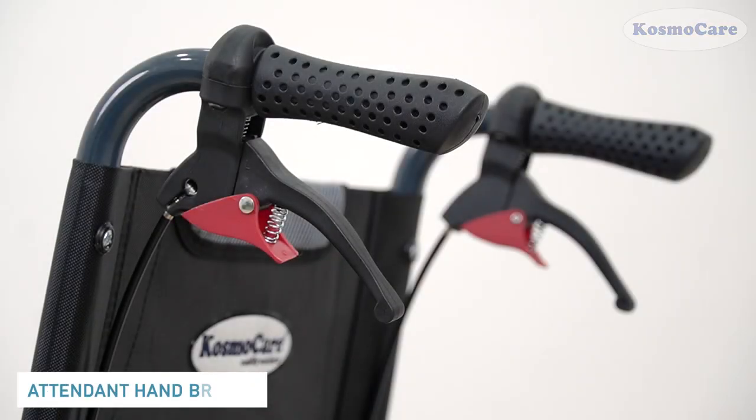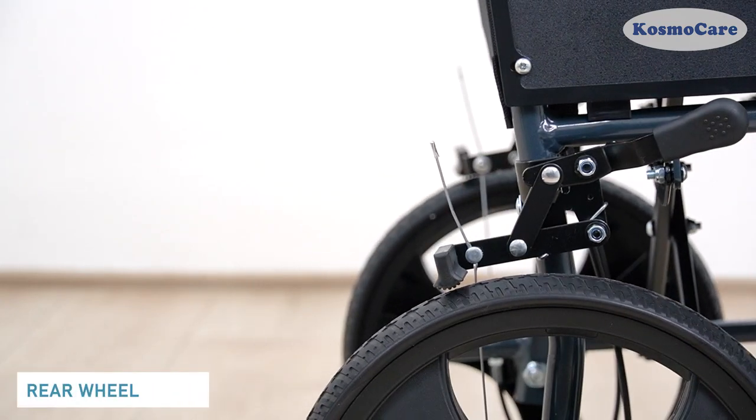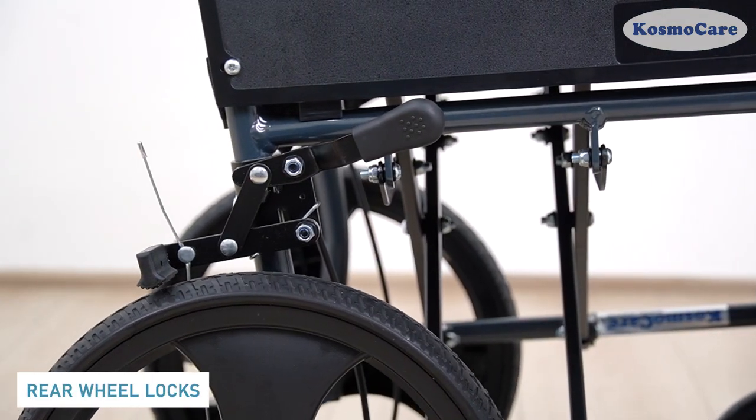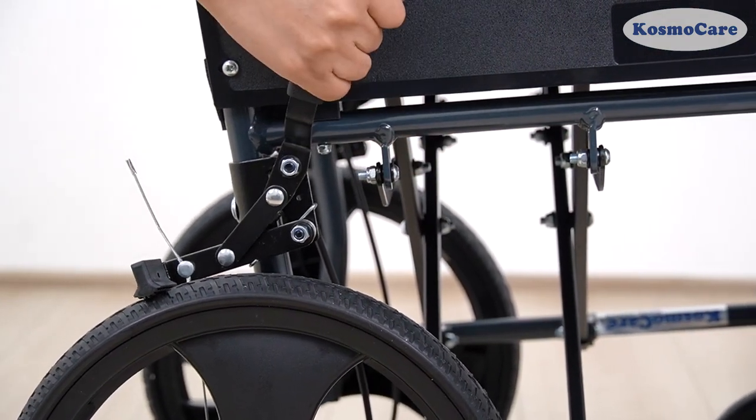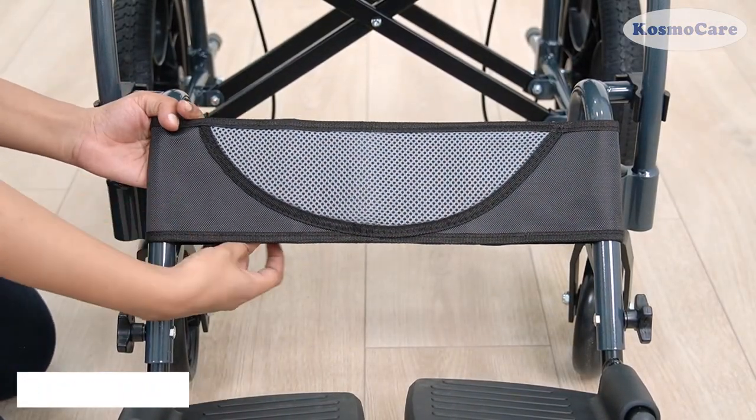The wheelchair is equipped with easy-to-apply brake levers for the caregiver. And when at rest, this accessible wheel lock lever securely locks the wheels. The footrest come equipped with a detachable calf strap to support the legs.